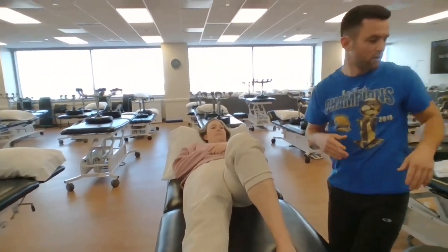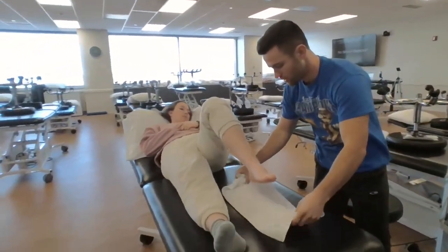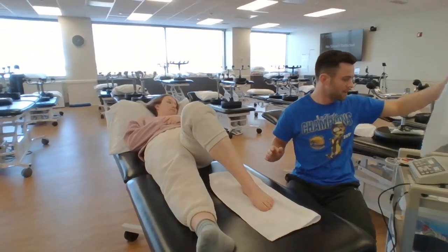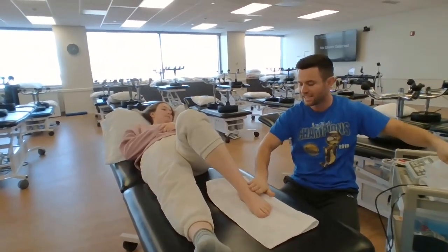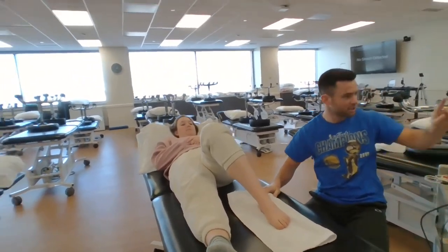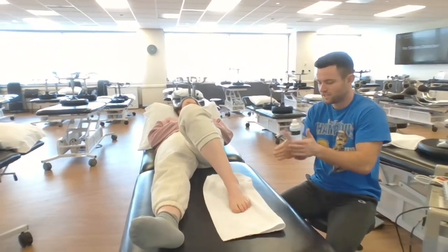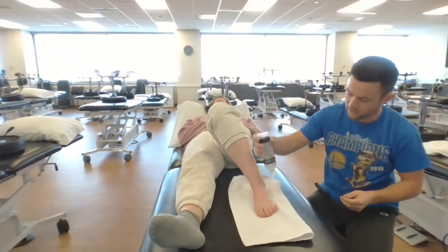Okay. Awesome. So I'm going to put one towel under your foot here, just because when we use this machine, we use gel to help it go. So it's going to be kind of cold, and it might be running off onto the table. That's why we have this towel here. And I just put it on this counter right here. Let me grab it. Great. Again, it's going to be cold. Sorry about that. We're just going to go ahead and put this gel onto the ankle here.